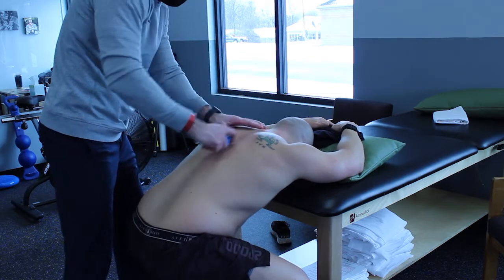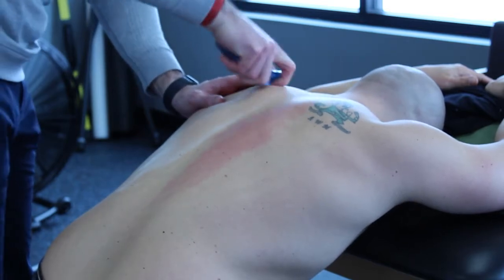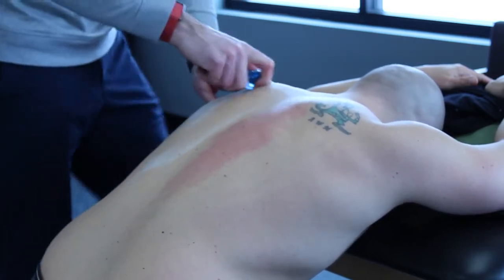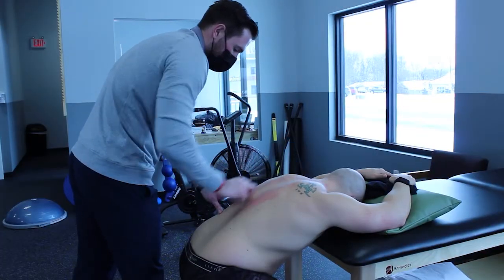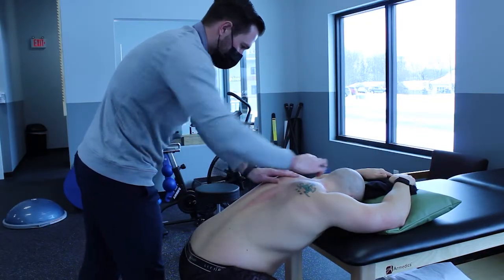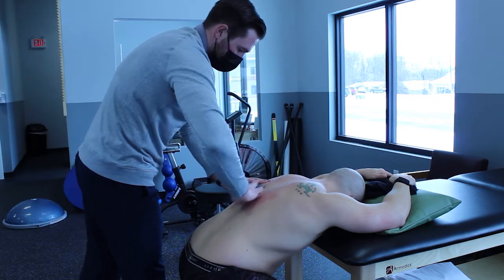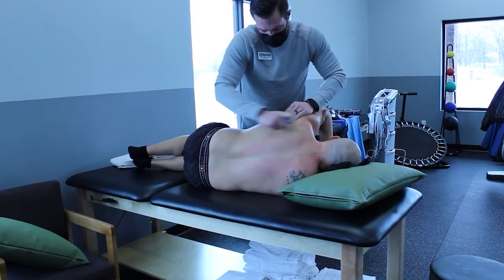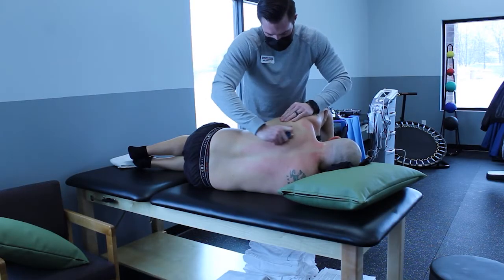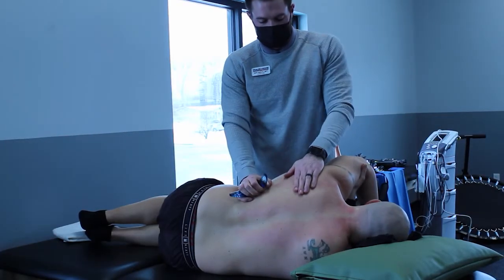Astym can be a great treatment for patients with neck pain. Decreasing tissue tightness in the cervical spine is an important manual technique and important to achieving the patient's goal for full flexibility. Realigning the tissues, decreasing pain, all goals for cervical spine treatments that can be added with Astym.